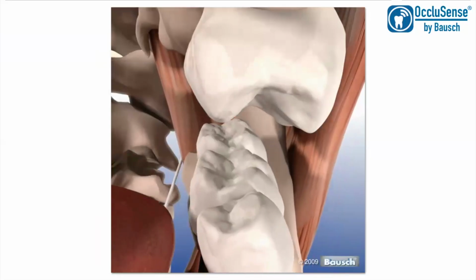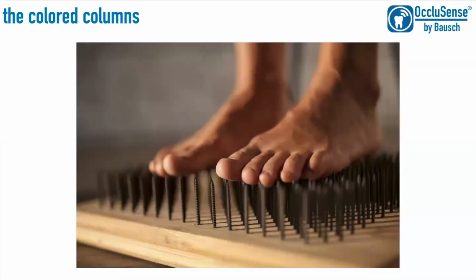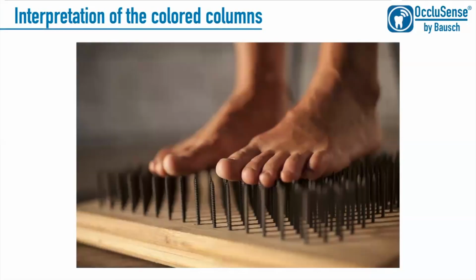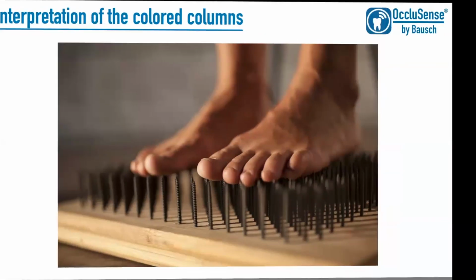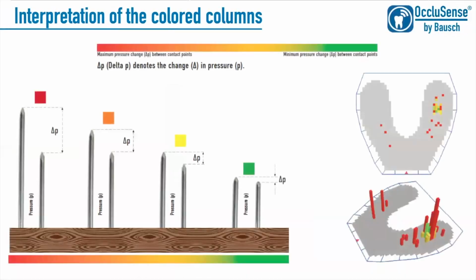How do we now apply this concept to the teeth, so to a clinical case of our patients? If you imagine that you're standing on a plate covered with needles barefoot, apart from the pain that you are sensing at the beginning, what you do actually feel is that the needles that press into the sole of your foot are applying different amounts of pressure. And what OccluSense does, or rather the pixels on the sensor, they compare each other and look at what the neighbor is doing.